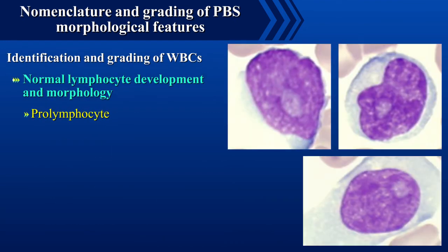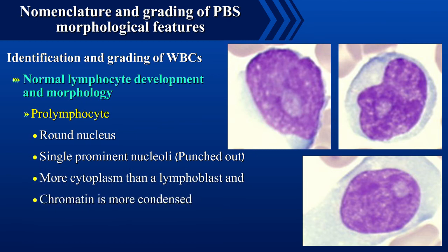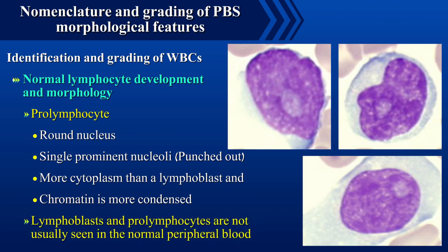Pro-lymphocyte has a round nucleus and a single prominent nucleolus. It has more cytoplasm than a lymphoblast and the chromatin is more condensed. Lymphoblasts and pro-lymphocytes are not usually seen in the normal peripheral blood.